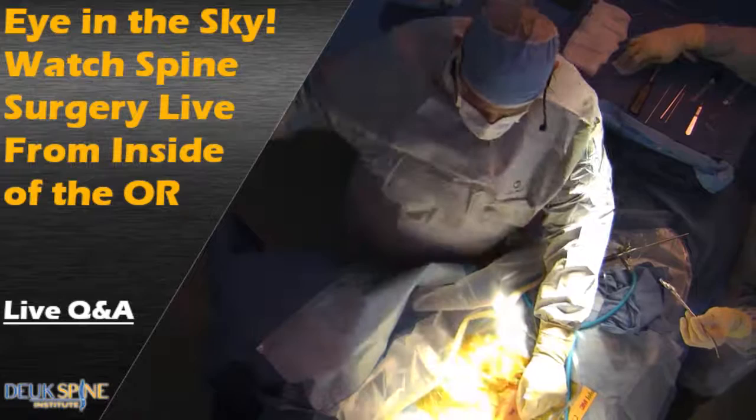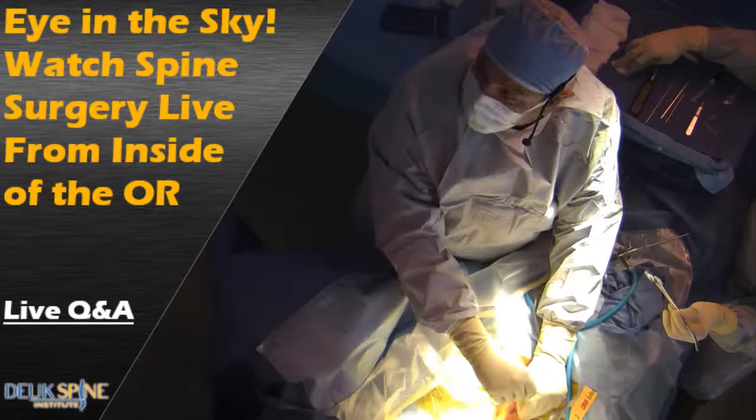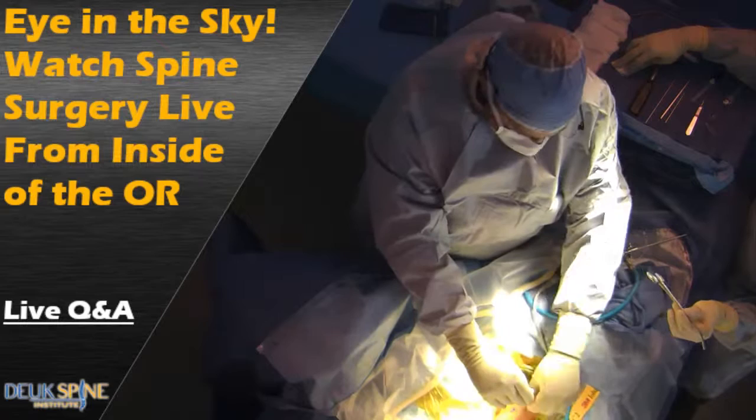All right, let's just see where we are. Good. All righty. How's our blood pressure? Good.